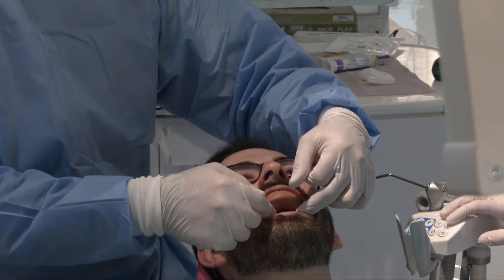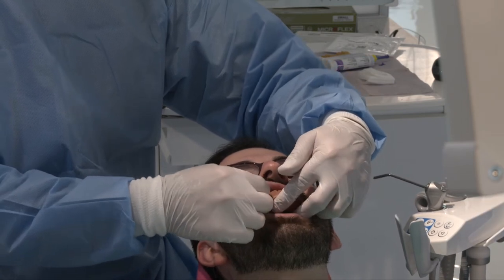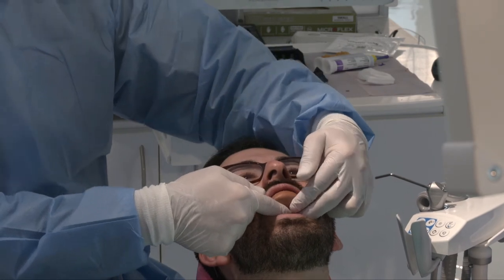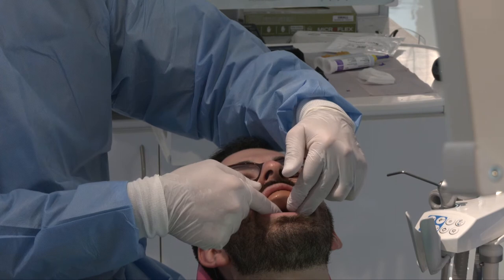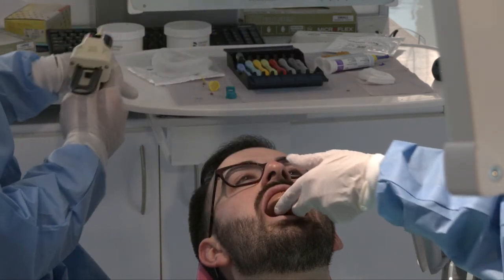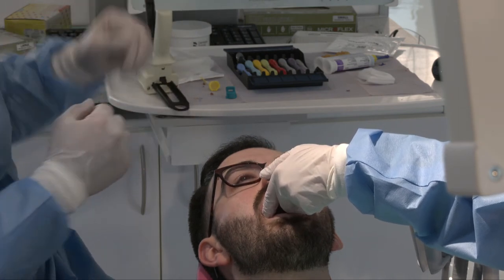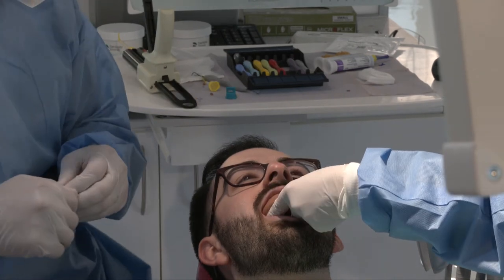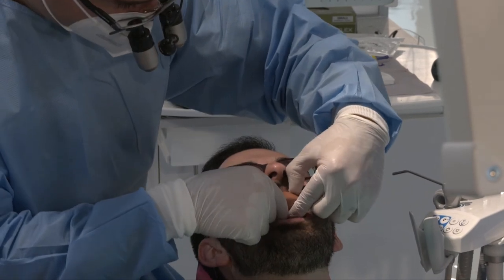And so here we are, we're letting this set up for about 2 minutes, and we're gonna go ahead and peel this off. And what's gonna happen, because of the accuracy of the intraoral scan and the wax up, you are going to have no trimming to do, and the material is going to break away right at the gingiva, and there's literally going to be nothing that you have to do. It's amazing how little cleanup you have to do when you do this. It's really accurate, and it shows that the scanner and the printer working together synergistically are very, very accurate.